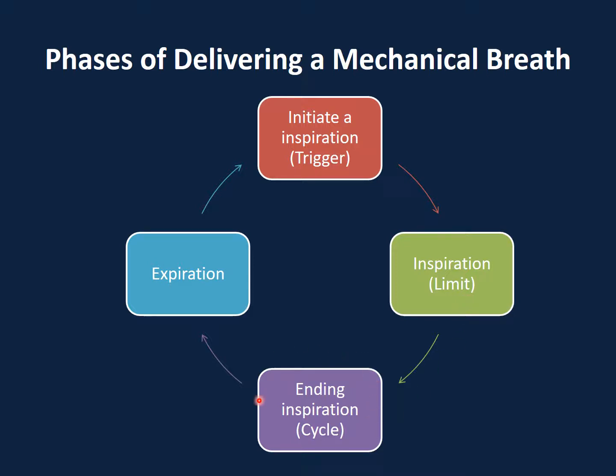When we say a breath is being cycled, the cycling refers to the ending of the inspiration. After the inspiration ends, exhalation occurs passively, and then the cycle begins again with the next breath.